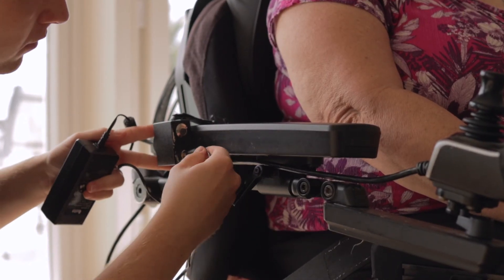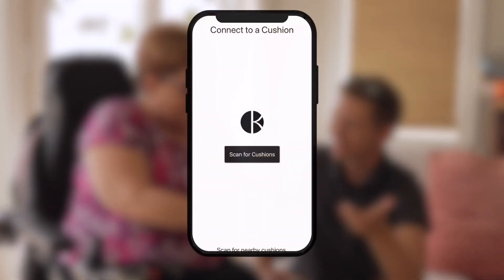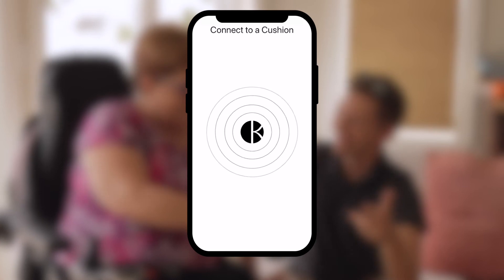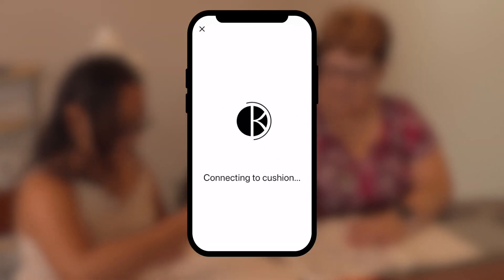Once the unit is connected and fully powered, you will be able to start customizing your Orbiter cushion with our app. After the Caligon app has been installed to your phone, you can connect your cushion via Bluetooth and begin the customization process to fit your personal needs.